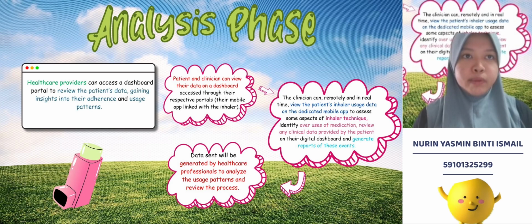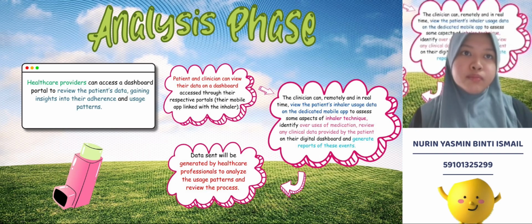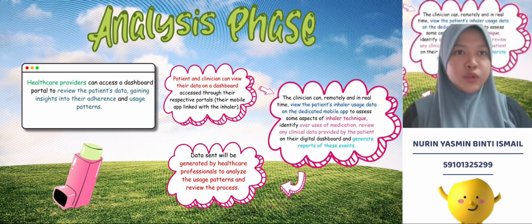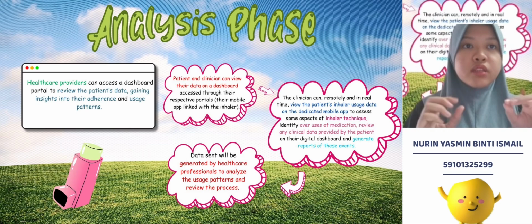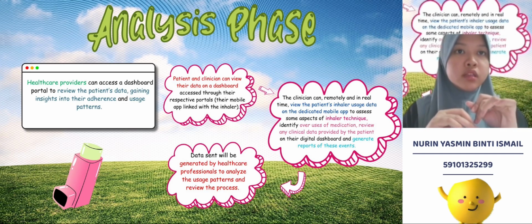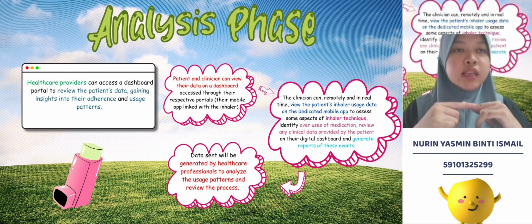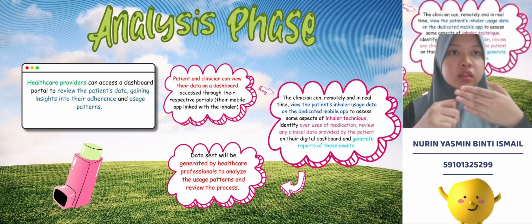Hi, my name is Nur Yasmin binti Mama Ismail. You can call me Yasmin. Today I'm going to present the analysis phase of smart inhalers. As we know, all patients that use a smart inhaler will download the smart inhaler app. Through the app, healthcare providers, which are doctors and nurses, can access a dashboard portal to review their patient data.